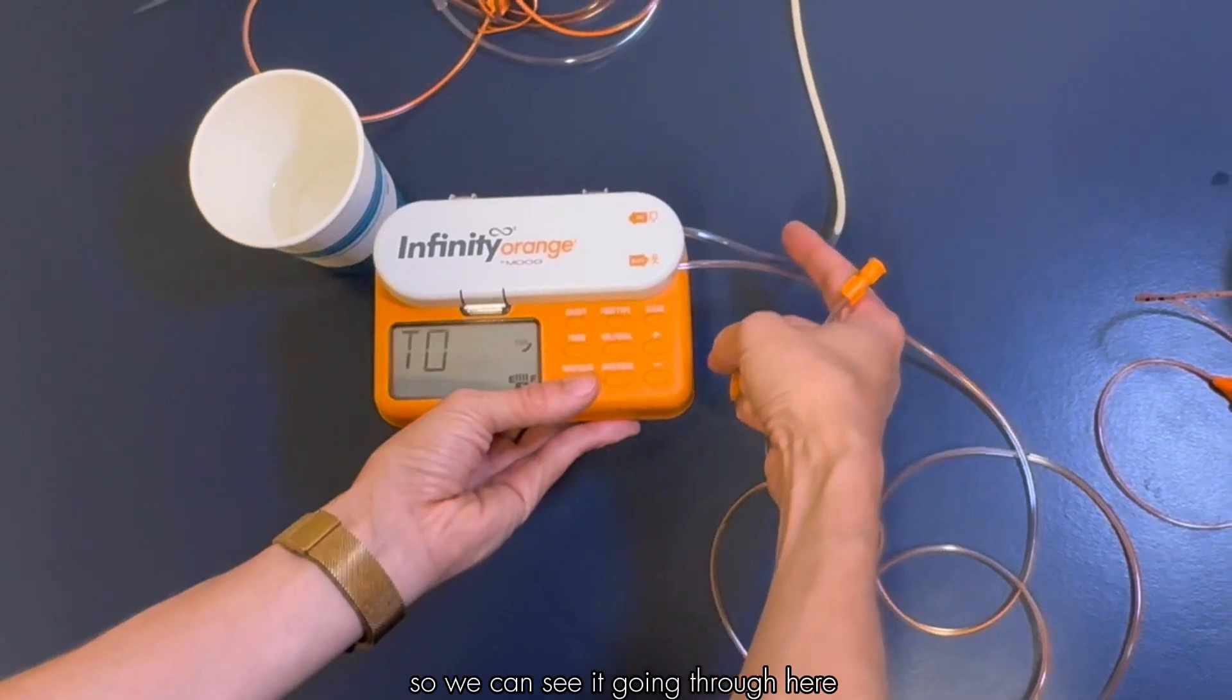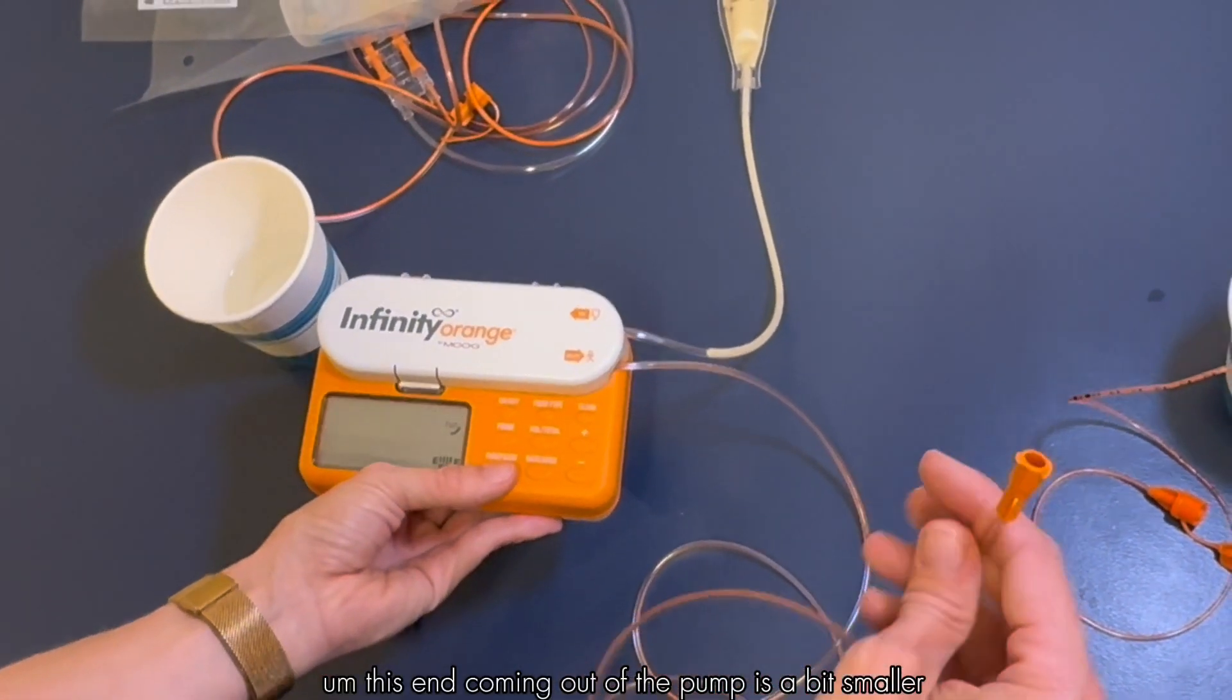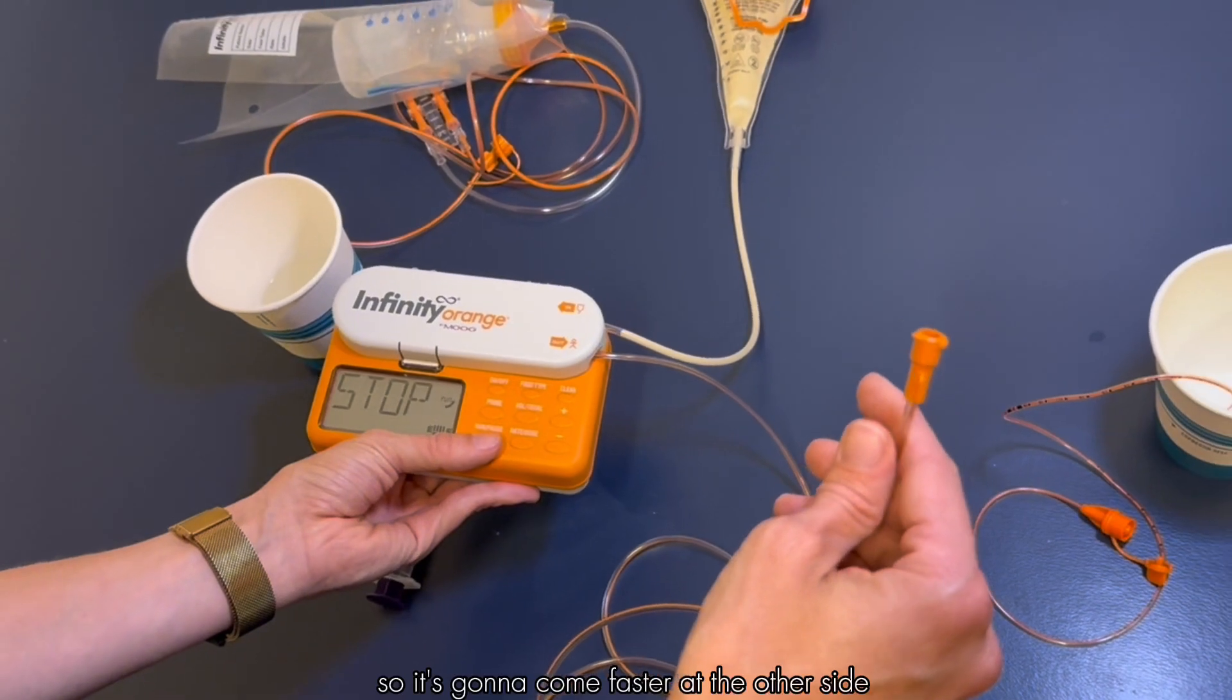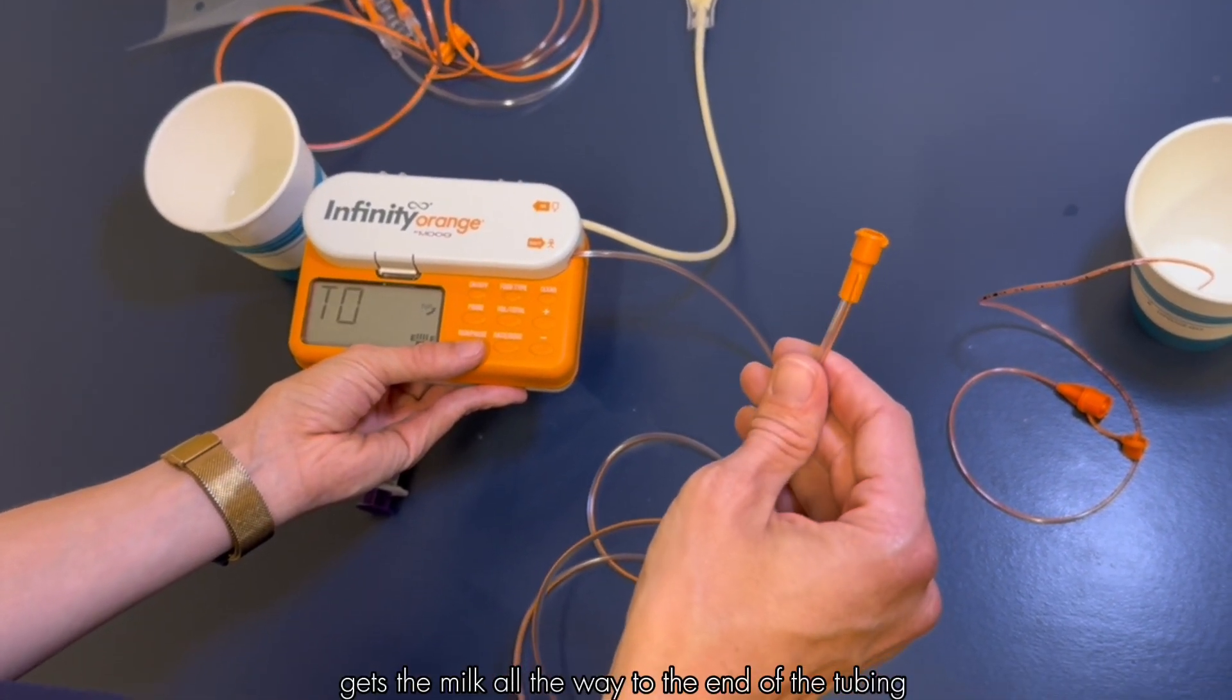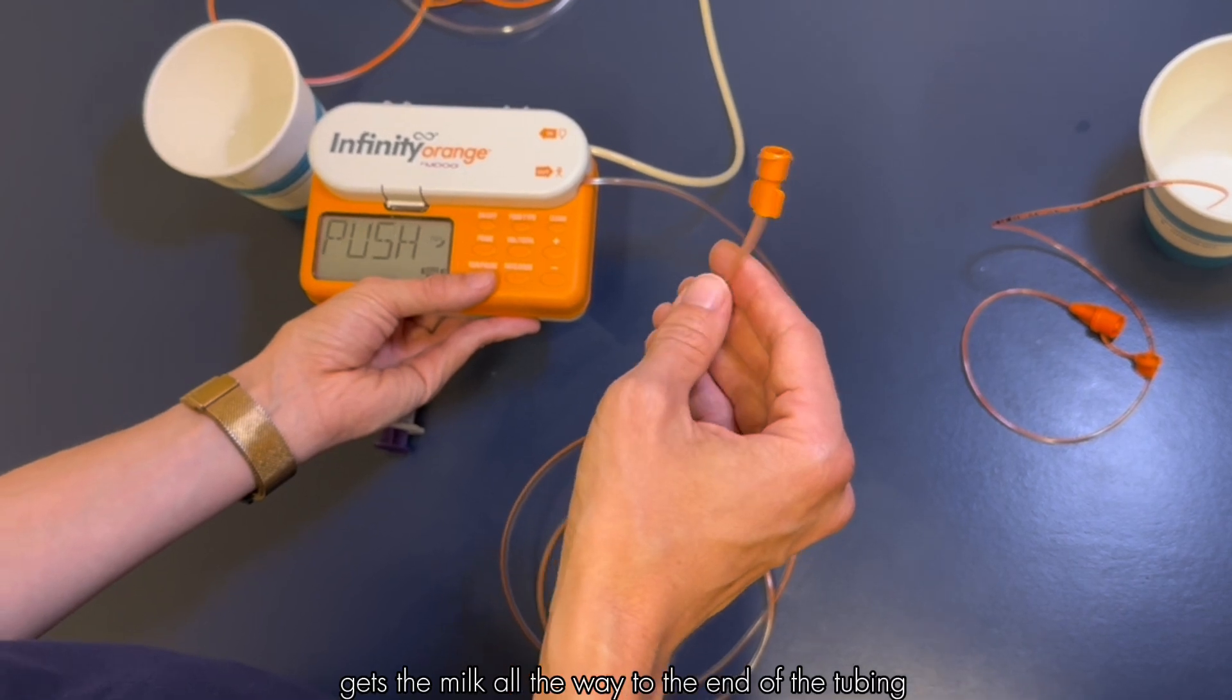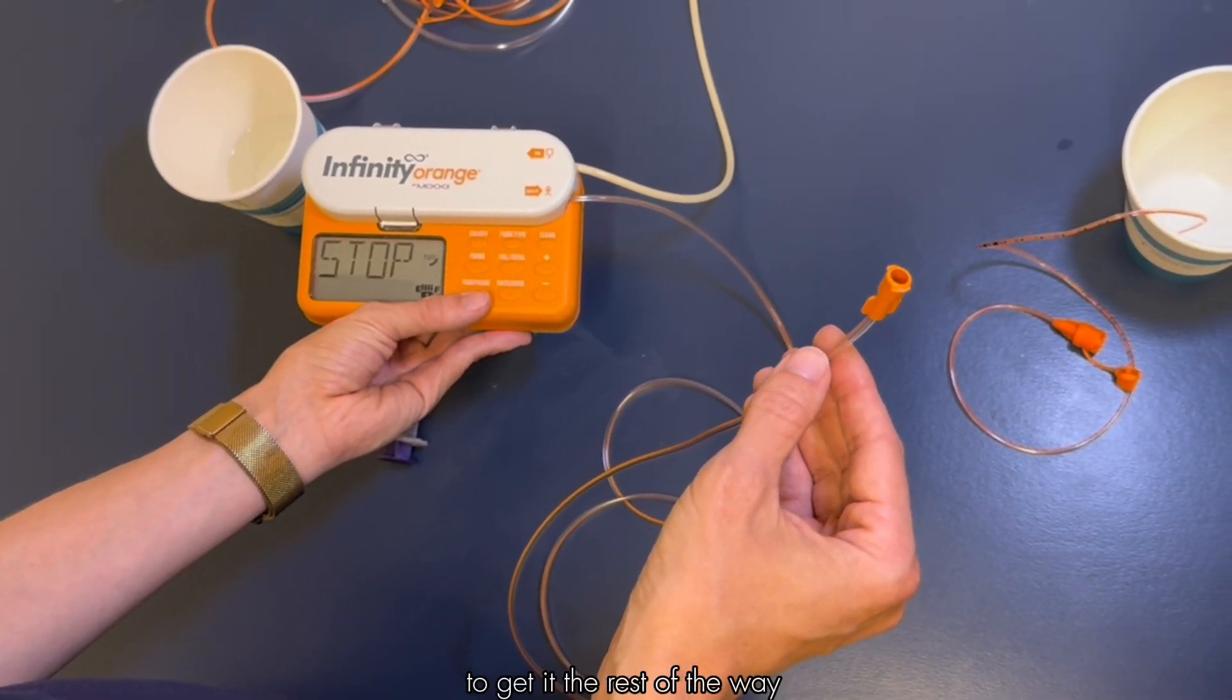We can see it going through here. This end coming out of the pump is a bit smaller so it's going to come faster at the other side. It might be that auto prime gets the milk all the way to the end of the tubing or it might stop a little bit before and then we can just hit the prime button again to get it the rest of the way.